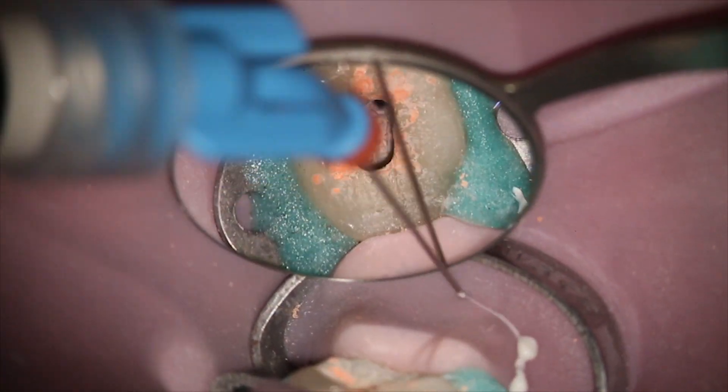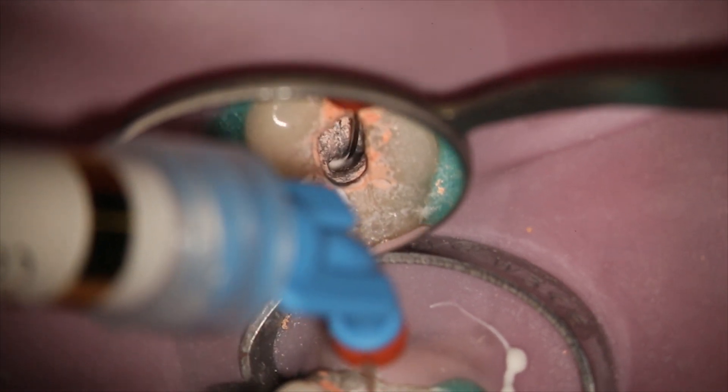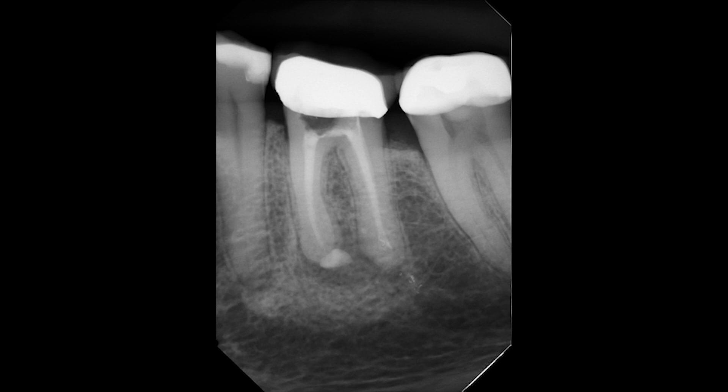The wicking is really the secret. Then we take our measurements, go in, and pack with calcium hydroxide. That's what the finished case looks like. We'll be packing this case when we see some radiographic resolution. At the second visit I'll probably do some more work apically, just to make sure the apical end of the root is properly instrumented.